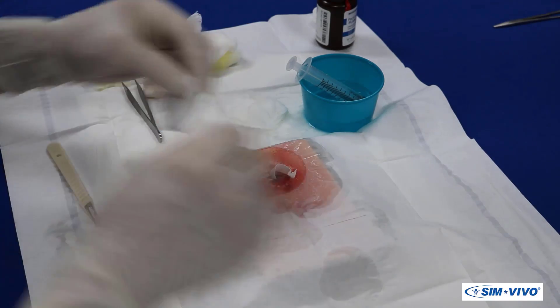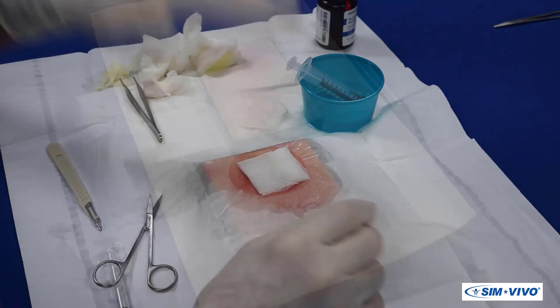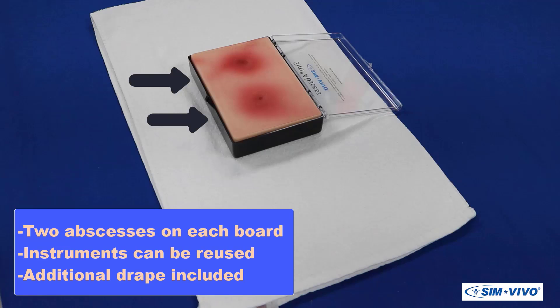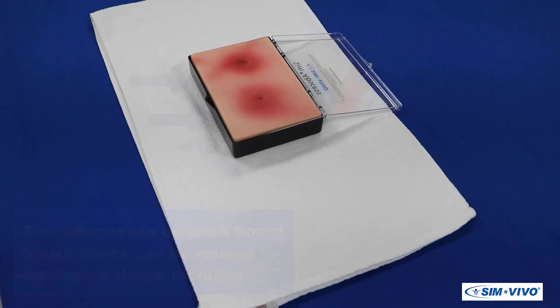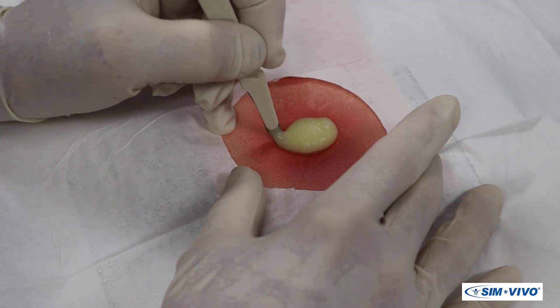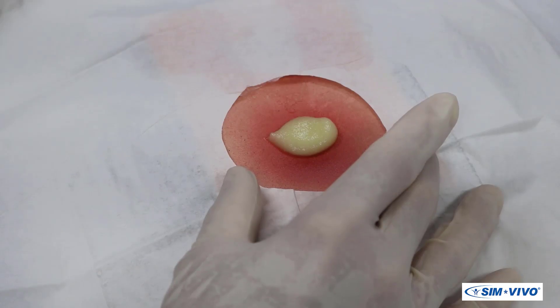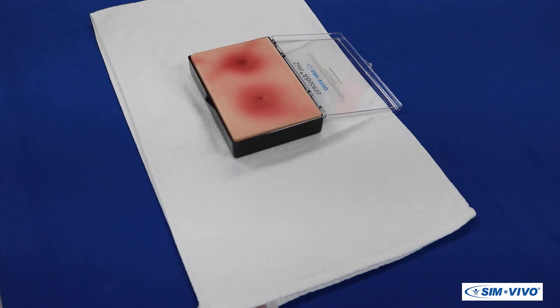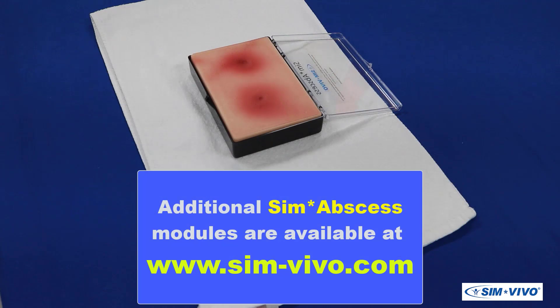A dressing is applied. Since two abscesses are on each board, this procedure can be practiced again. Materials and instruments will be assumed to be re-sterilized and available for the second procedure. Congratulations! You have just performed a procedure that has alleviated pain and reduced recovery time from a problem with potential complications. If you want to practice further, additional SYM abscess modules are available on the SYMVIVO website. Best of luck in your continued surgical training!